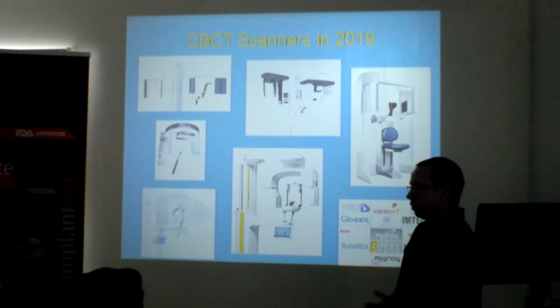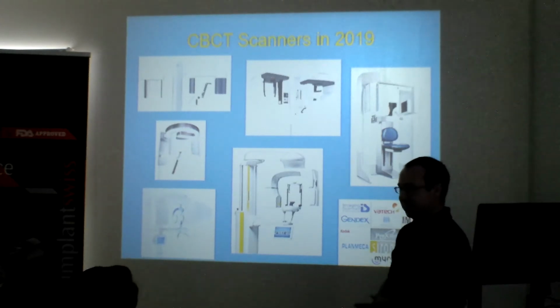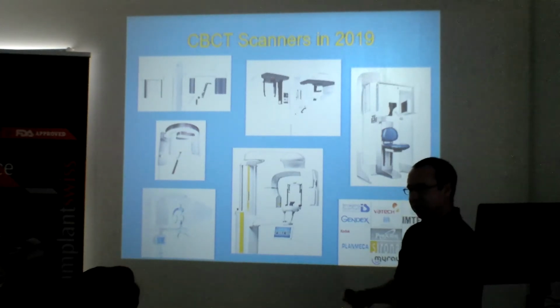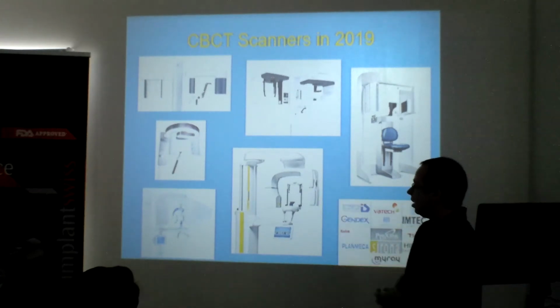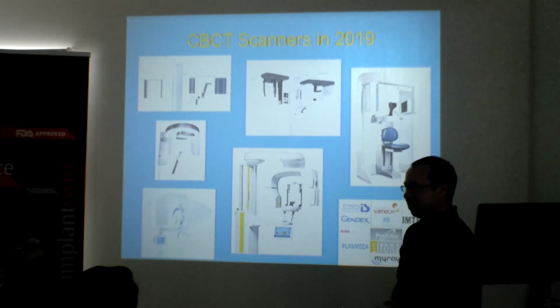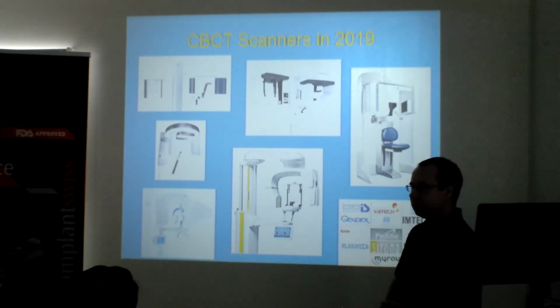It can also have a field of view that goes down to a 2 centimetre diameter. So we're now talking of just imaging a single tooth, literally. And this is something I would love for the future. In general radiography, you have a collimator board on your X-ray machine, so you can pull in from side to side. Cone beam CT, it's not quite there yet, but we have asked the engineers. Every time they come in and say, what do you want? A proper collimator board, please, so we can literally get down to the smallest field possible.